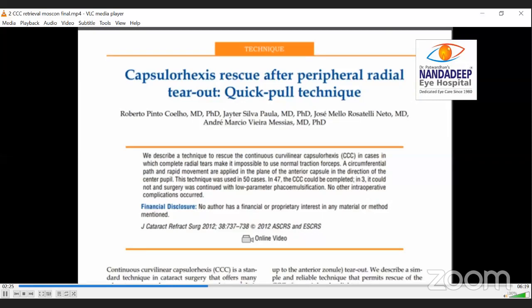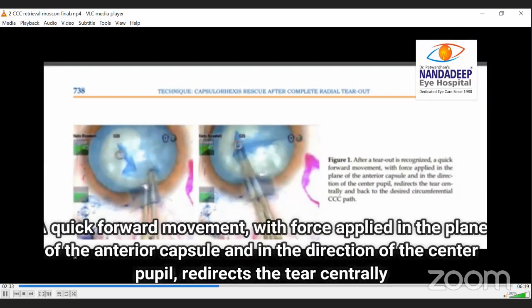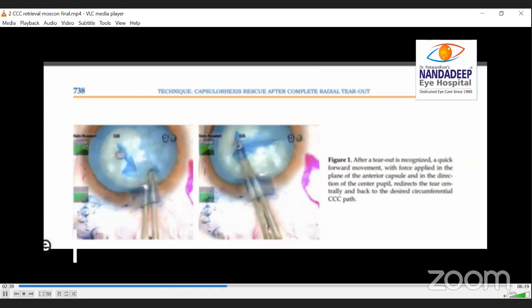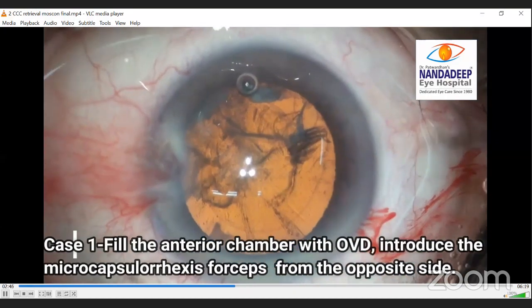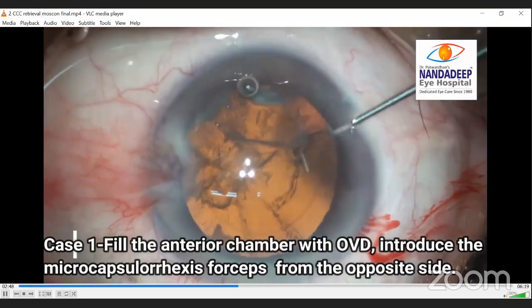So what is this quick pull technique? We'll see some of the cases. This technique was described by Dr. Coelho and Dr. Rosatelli and his colleagues. So there is a quick forward movement with force applied in the plane of the anterior capsule. So it's a quick central pull on the anterior capsule. The most important thing is it has to be quick and it has to be exactly central.